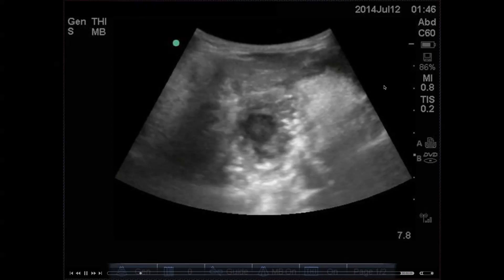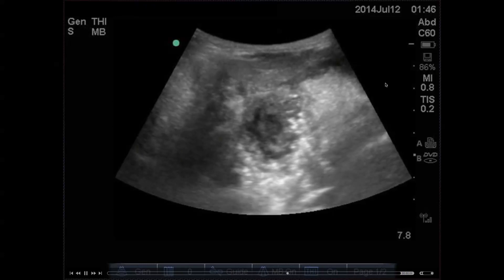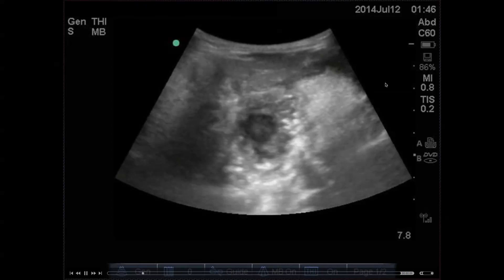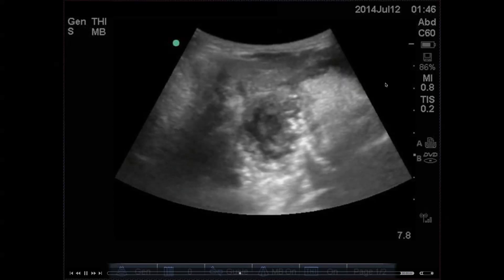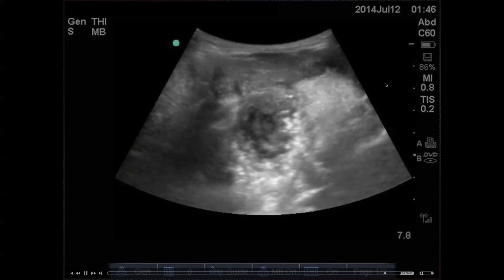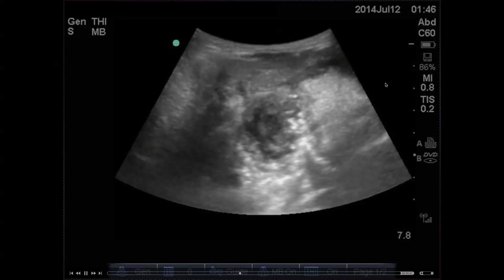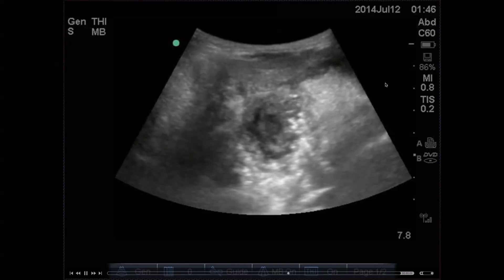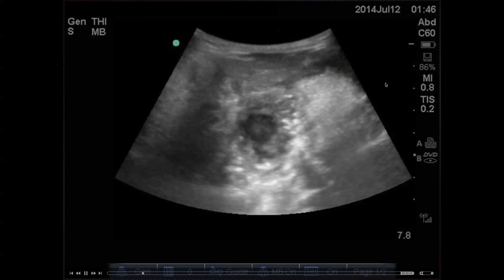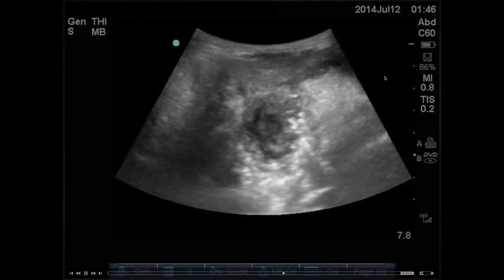So we're going to do what I call a telescopic submandibular approach. It's telescopic because from the Greek — tele means at a distance, scopes means to see — so we're seeing and guiding from a distance. This is the only procedure I can think of where the probe and needle are not in the exact same place. The probe is still on the outside underneath the chin and the needle is going to go in the mouth.